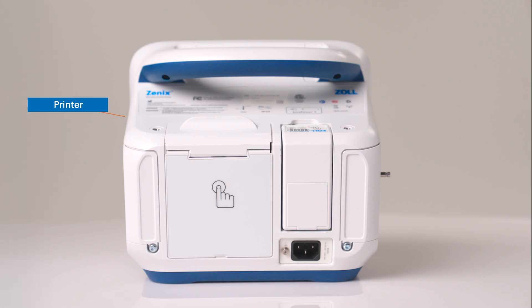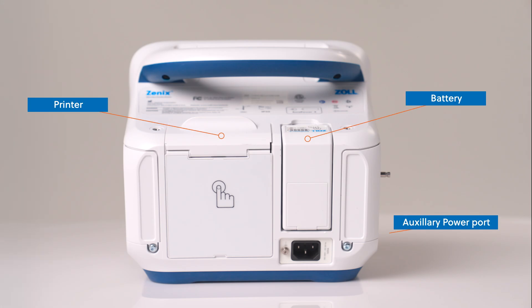Located at the back are the printer, the SurePower 4 battery and compartment, and the auxiliary power port.